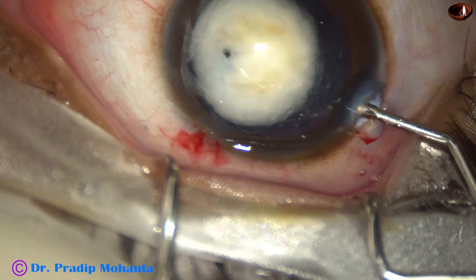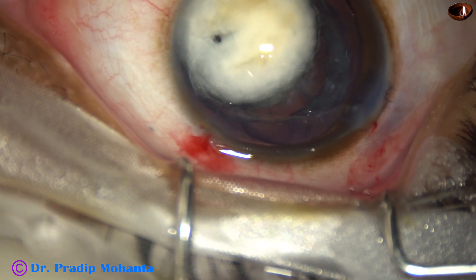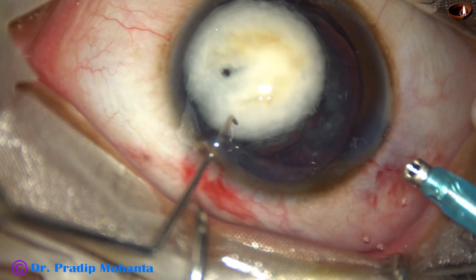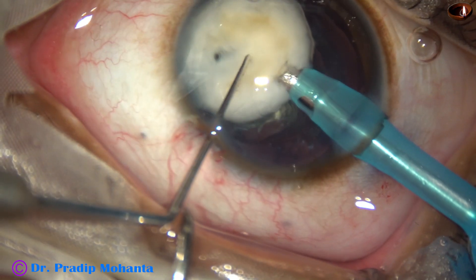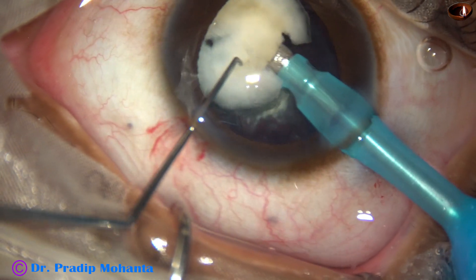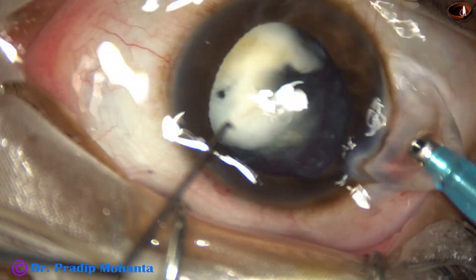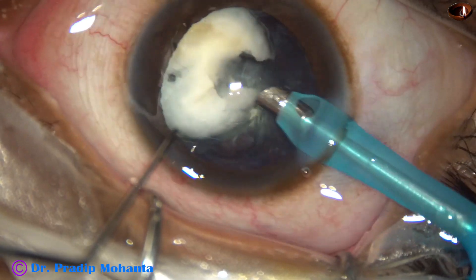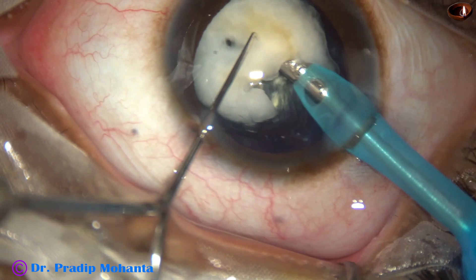And now I inject viscoelastic both above and below this lens nucleus, and use the phaco handpiece to manage this lens nucleus. You can see some brown areas, and I believe there is hard lens matter. This is a stone piece — so the lens matter has altered over the years and has become very hard in places, like stone.